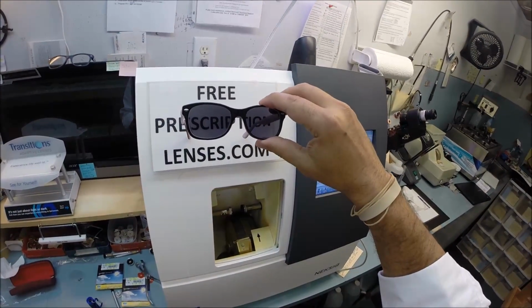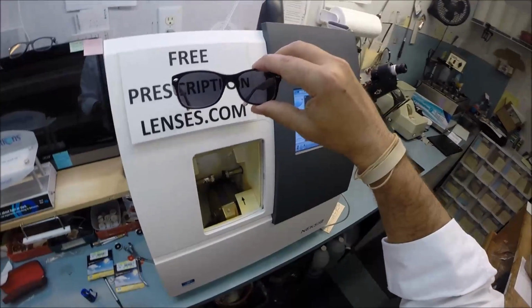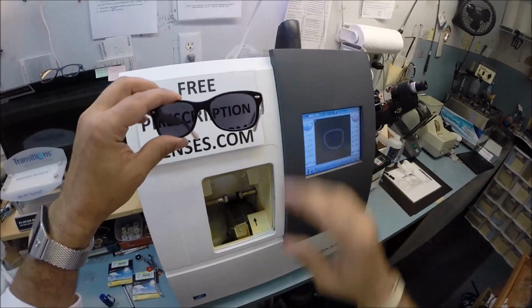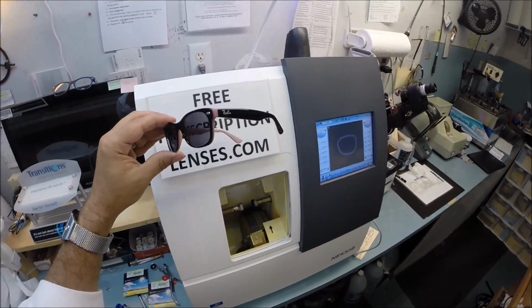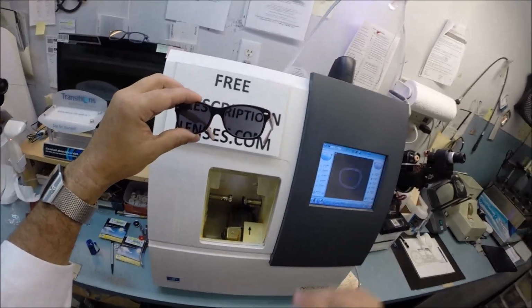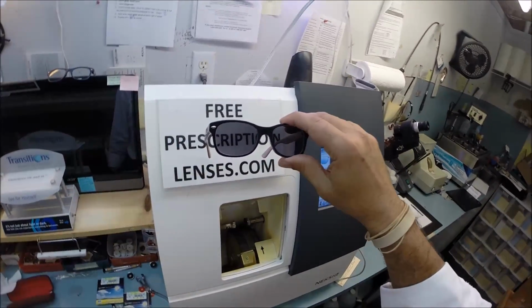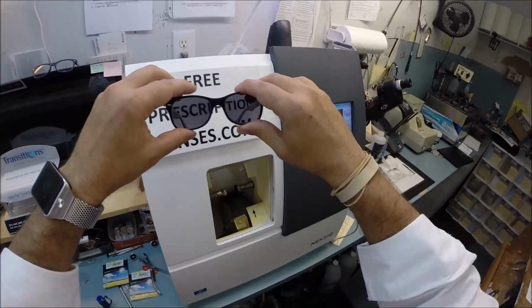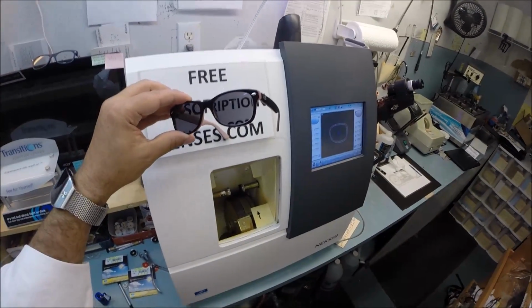Now, they're also temperature sensitive, meaning they will get darker when it's 85 and below than they will when it's 95 and above. But I don't think you get too many 95-degree days there in Morley, Michigan. Unlike here in North Carolina where it gets hot. Oh, it gets so hot and humid here. So, that's the first time they've been activated. Don't worry, they will get darker than that.